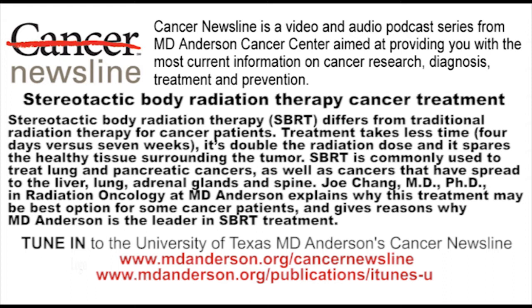The unique part of SBRT is to deliver very high biological dose to the tumor, in the meantime minimize the dose exposure to the surrounding critical structure. Compared with conventional radiation therapy, which requires 7 weeks of radiation therapy and about 70 grays of biological dose, stereotactic radiation therapy delivers double the dose within 1 week.